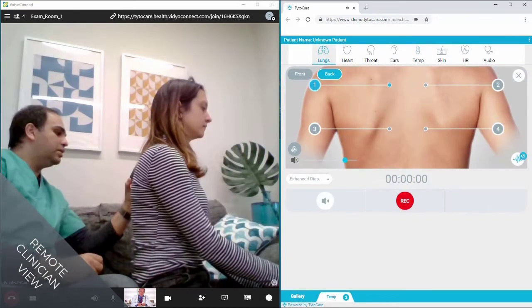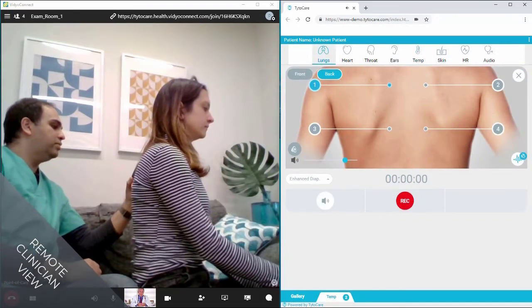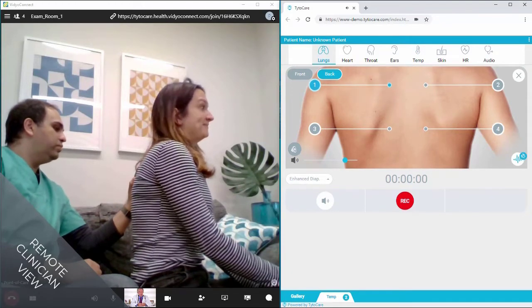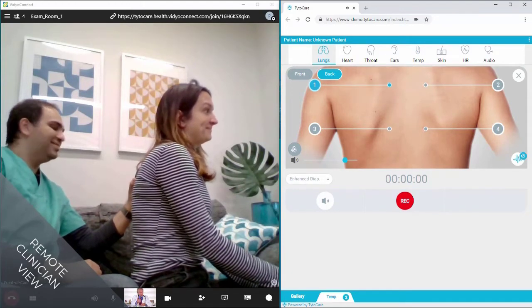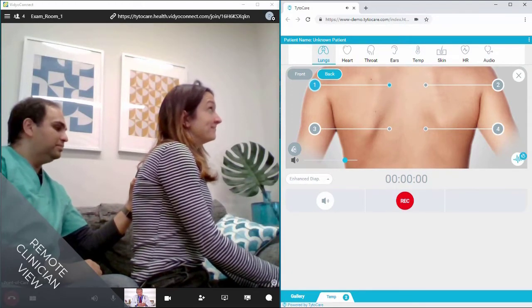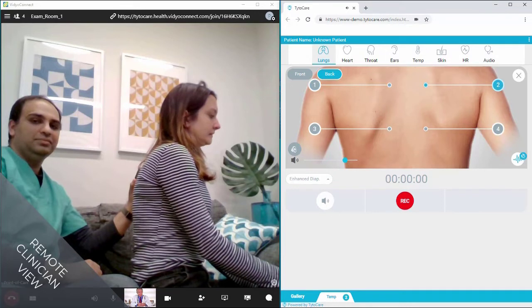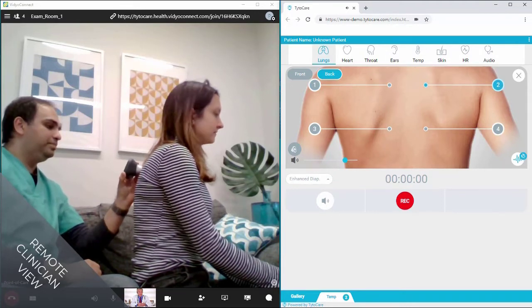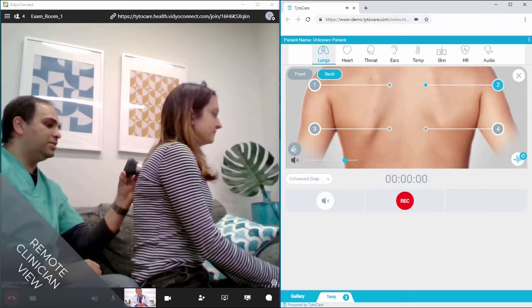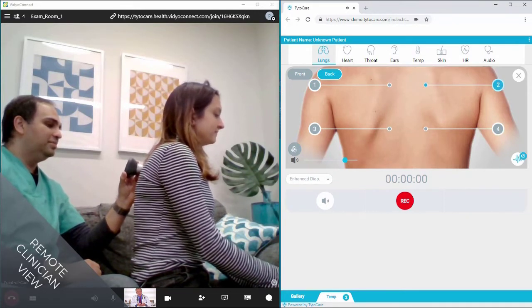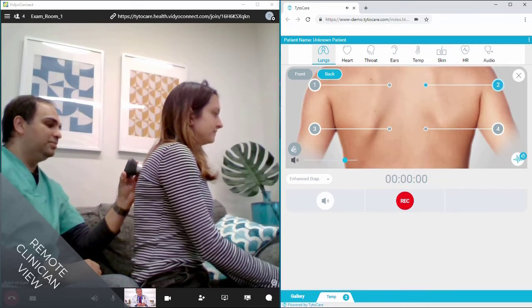The remote clinician prompts the point-of-care provider to use the specific device attachment needed for the exam. The point-of-care provider receives clear visual instructions on the Tytocare device while the remote clinician guides them through the assessment.